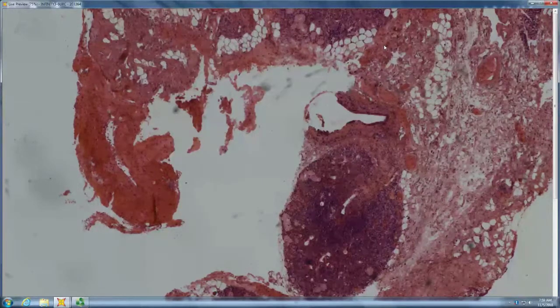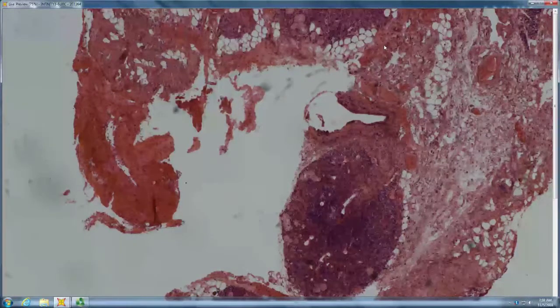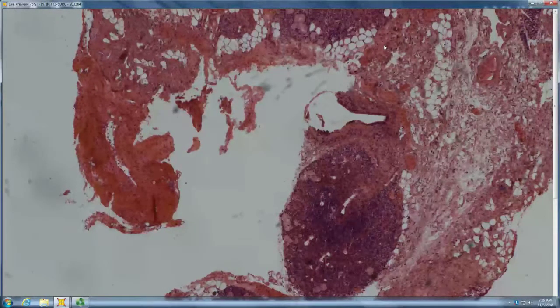Working on a mucocele, doing a salivary gland biopsy, you never snip. What do you never do? Snip. Correct. You spread, so you just make an incision there. You don't have to cut a wedge out. Just make an incision. You go in with your Gradle or iris scissors and you just spread, and then you squeeze and out pop little round things. Those are the minor salivary glands. You just drop them in a bottle. What do you never do? Snip. Correct, because you can leave someone with permanent numbness there.